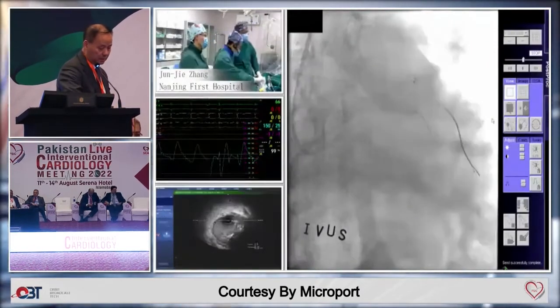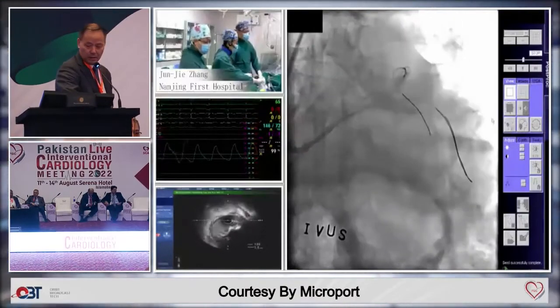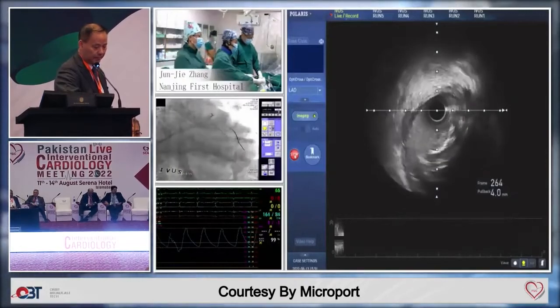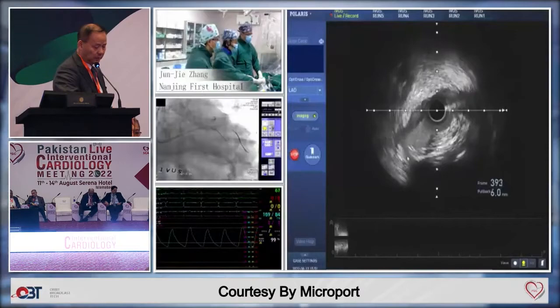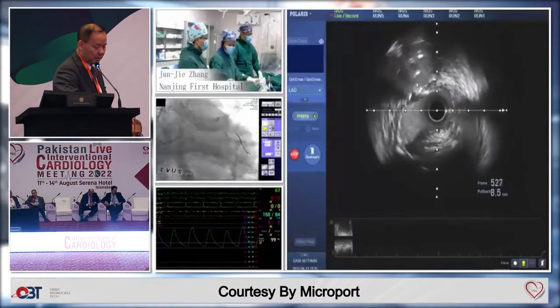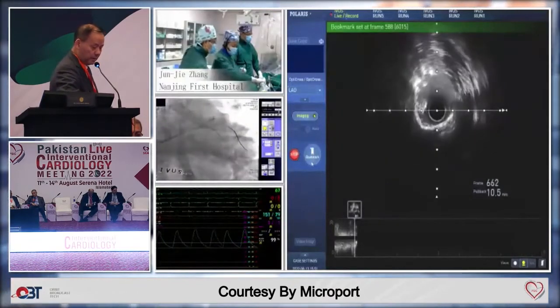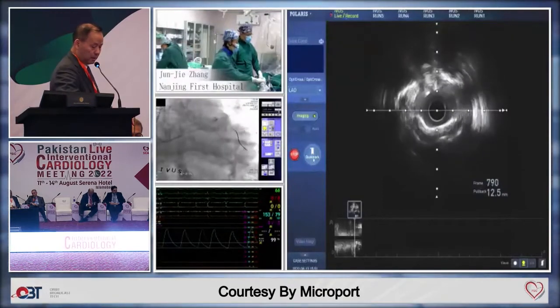Dr. Panta, please check the IVUS. Yeah, I will pull back the IVUS. Can you see the IVUS imaging? Not yet. Okay, now. The IVUS, this is the proximal LAD. We can see the media dissection. And here we can see the circumflex wire in the LAD. Yeah, it's from proximal. We're sure it's passing through the proximal cell.